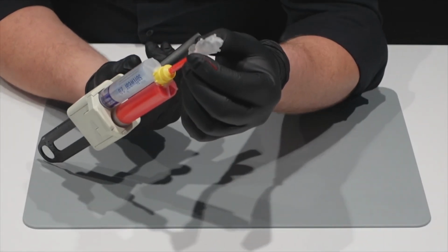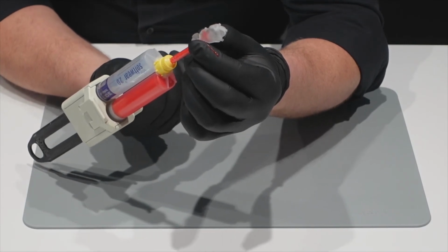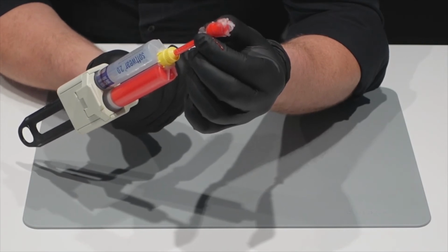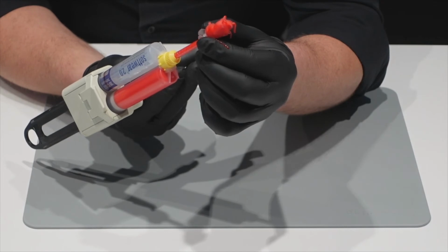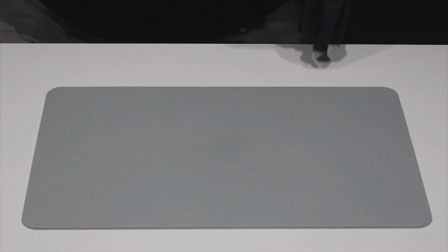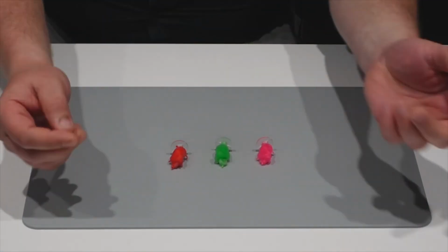Take it here inside, fill it up from the bottom in this direction. And you can see also the crush line, it works absolutely fine. There's no area that's deformed or something like this. And it is much easier to open it later. Okay, this is the filling process. I think it's clear. And now take it to the pressure box. It takes 20 minutes and then you are safe. It is 100% cured. And after the pressure box, when the silicone is cured, you get this result here.